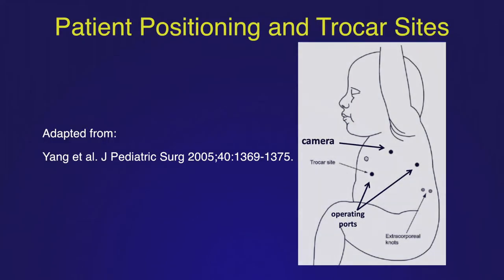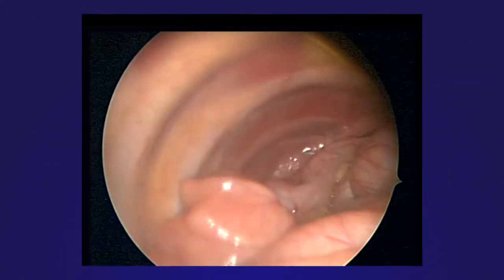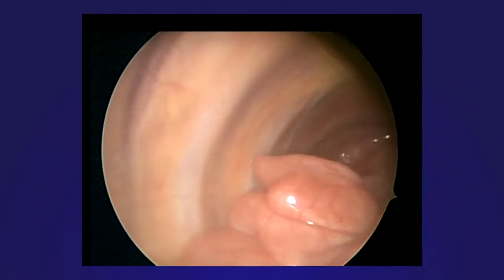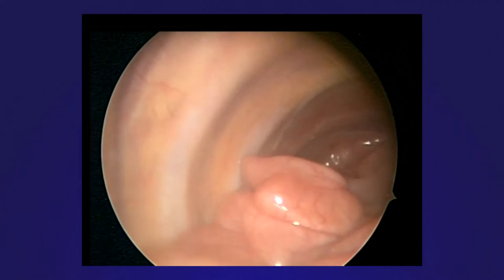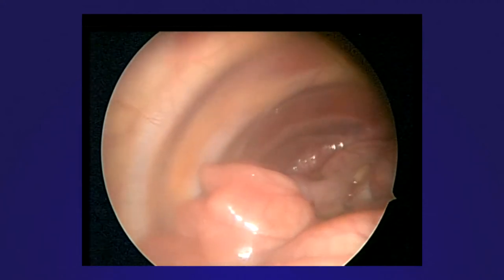The positioning and port sites for the procedure are shown here. An insufflation pressure of 6 mmHg and a flow rate of 2 liters per minute are used. Herniation of the small and large bowel can be seen.